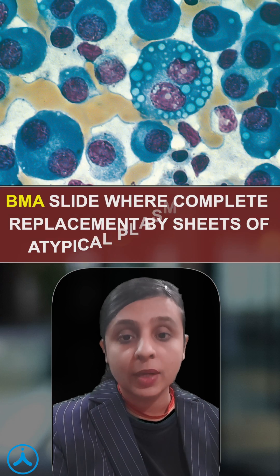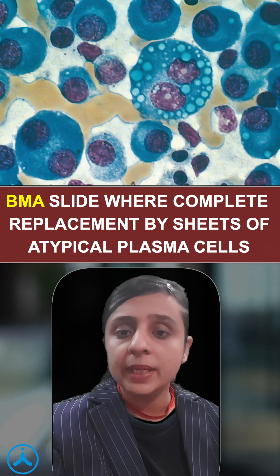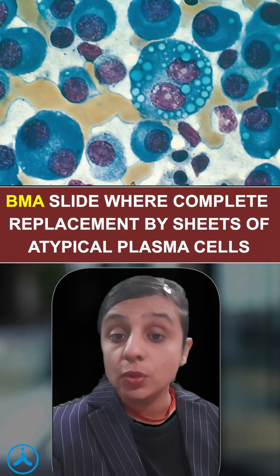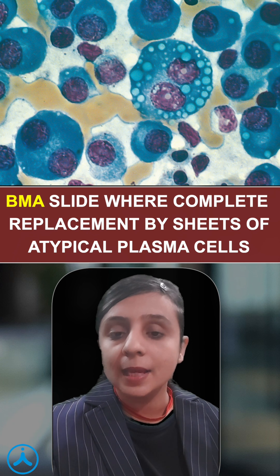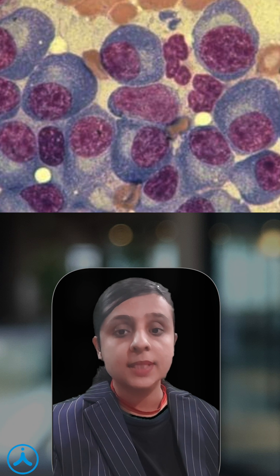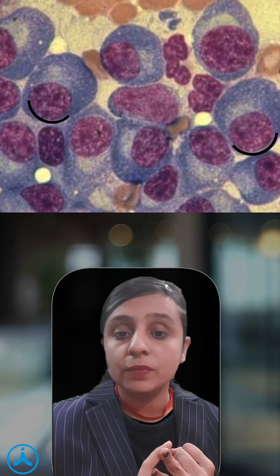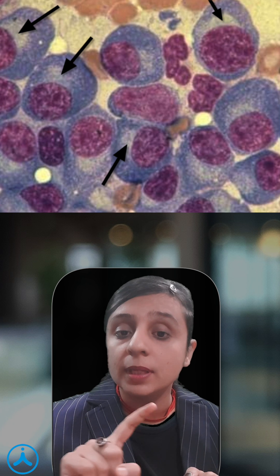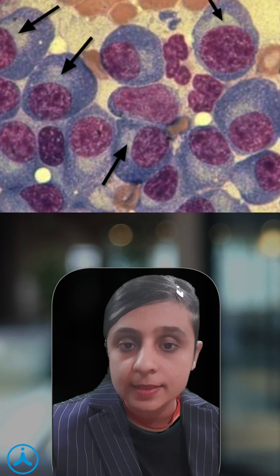Next we can see a bone marrow aspiration slide where complete replacement of the normal underlying bone marrow elements is seen with these abnormal plasma cells. Now how do you identify plasma cells? They are characterized by an eccentric nucleus along with the presence of a perinuclear halo, which is formed due to the underlying Golgi apparatus.